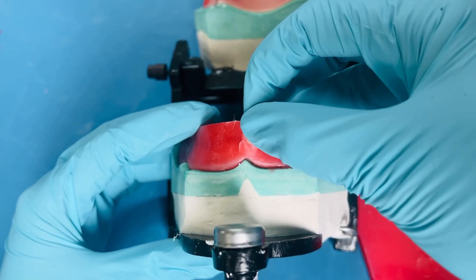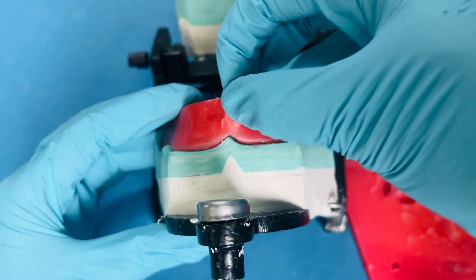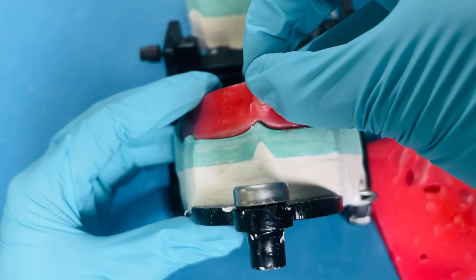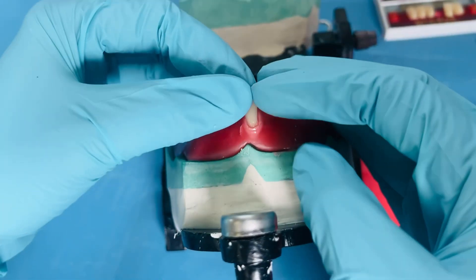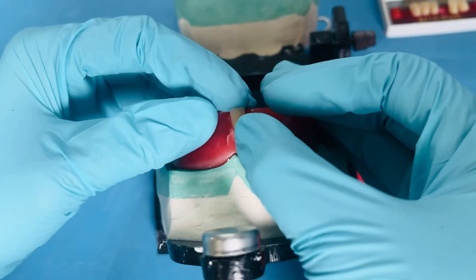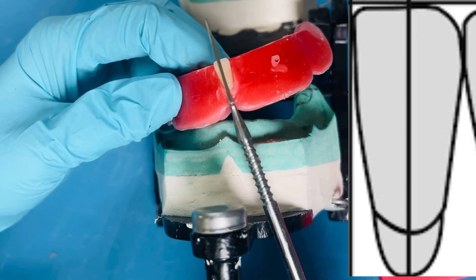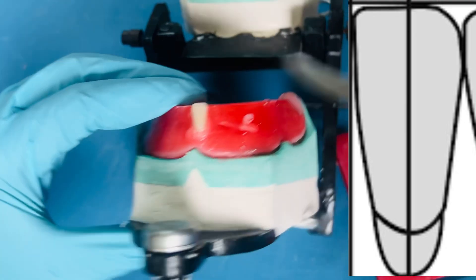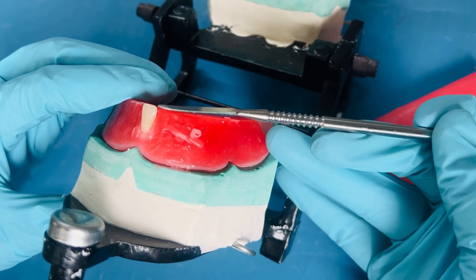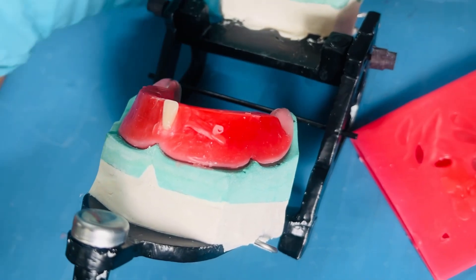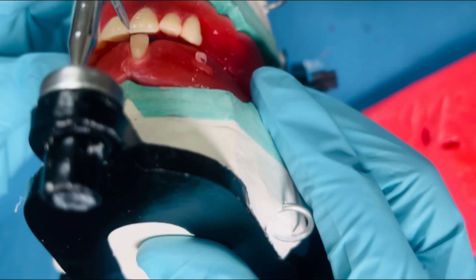Hi dears, this is a continuation of my previous video on maxillary anterior teeth arrangement. We shall begin with the mandibular central incisor. The long axis of the mandibular central incisor is kept straight when viewed from the front and side. The incisor edge of the tooth is kept 2 millimeters above the occlusal plane.